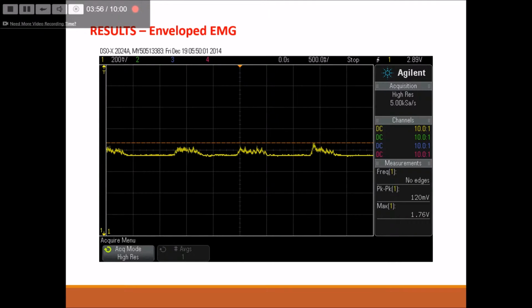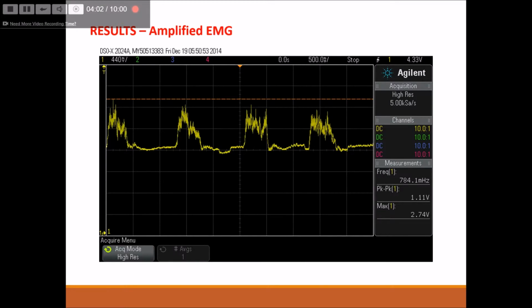Then we envelope the signal, which does decrease the amplitude a little bit, but it also gets rid of some of the high frequencies. And then finally at the very end we put it through our programmable gain amplifier, and you can see that the peak to peak that we get is about 1.11 volts, which is plenty for the microcontroller to tell.